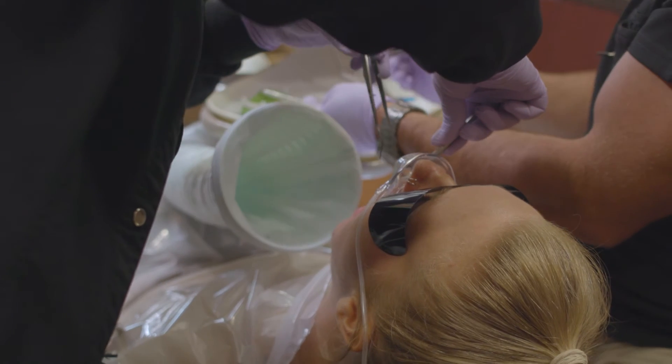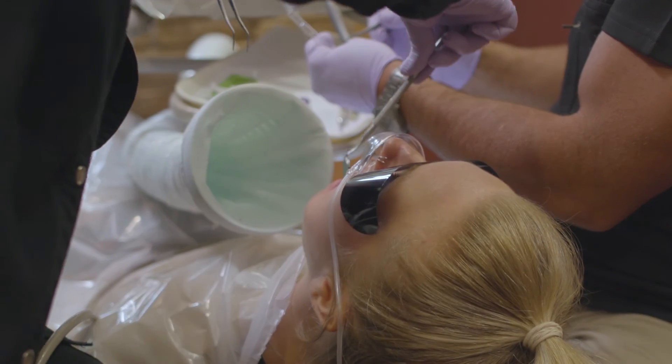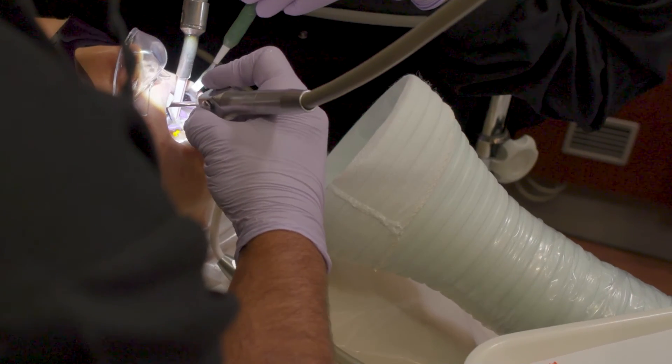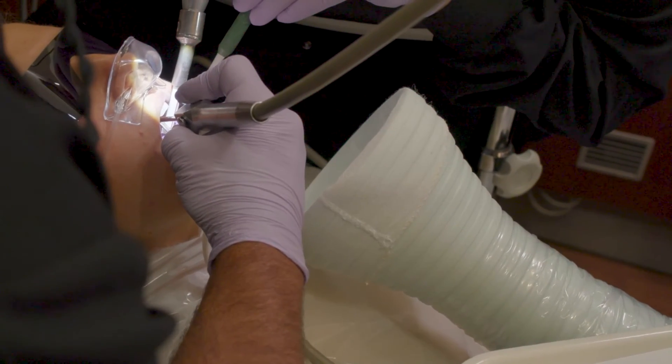We also use an at-source vacuum, which is a large suction device that we place directly at the source of where we're removing the fillings. This helps circulate the air and, more importantly, removes overspray and any possibly harmful mercury vapors that occur when we remove these fillings.